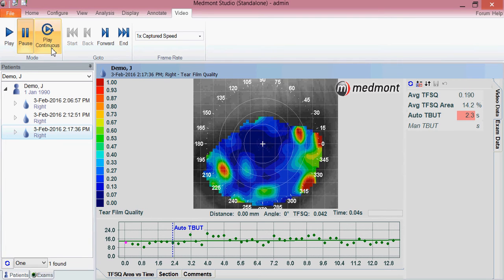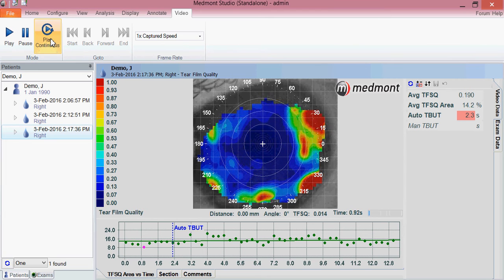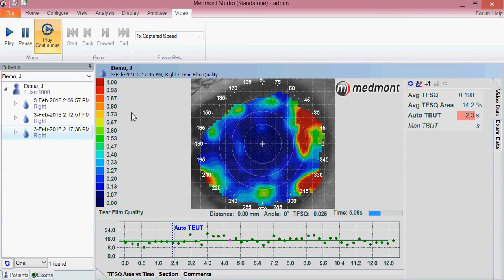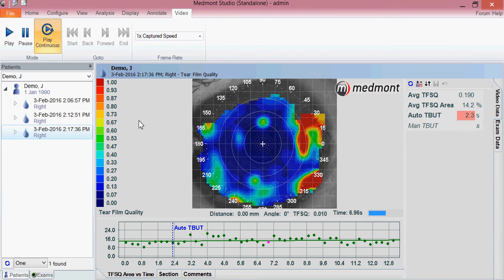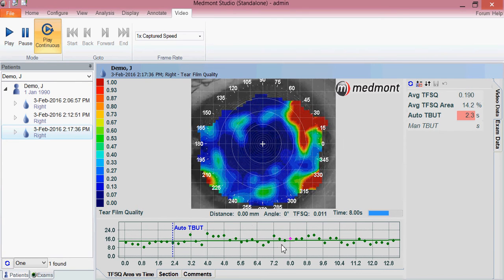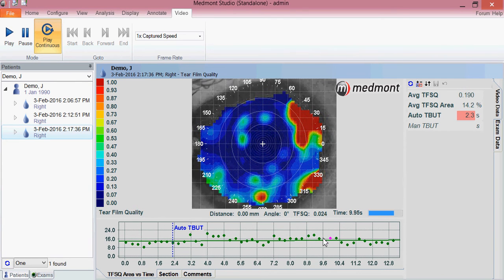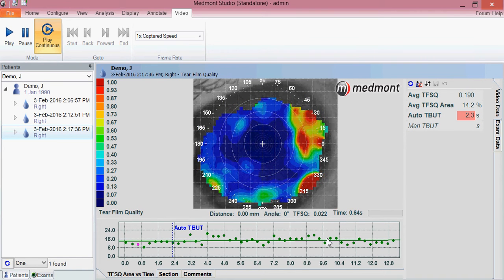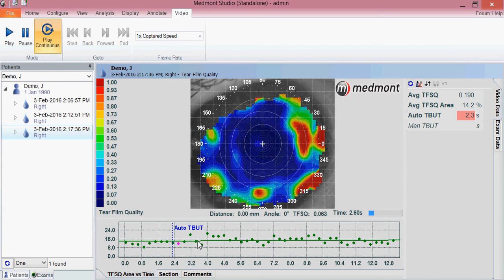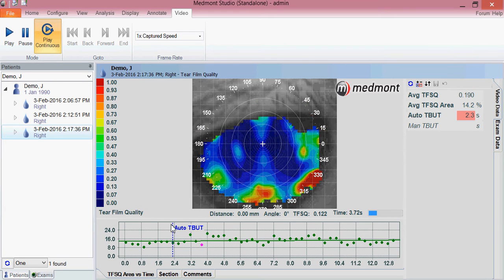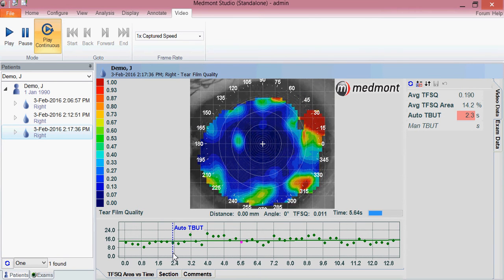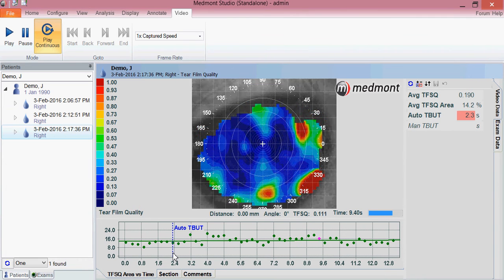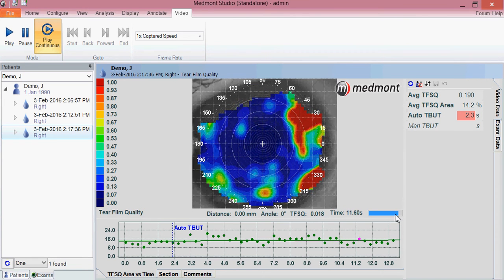We can play this as a continuous loop to assess the quality of tear film changes over time. Each pink dot corresponds to which image is being displayed at the point in time that it was captured. We can look at this blue line here as the indicated point of tear breakup time, or what the instrument believed was the point where there was tear film breakup.